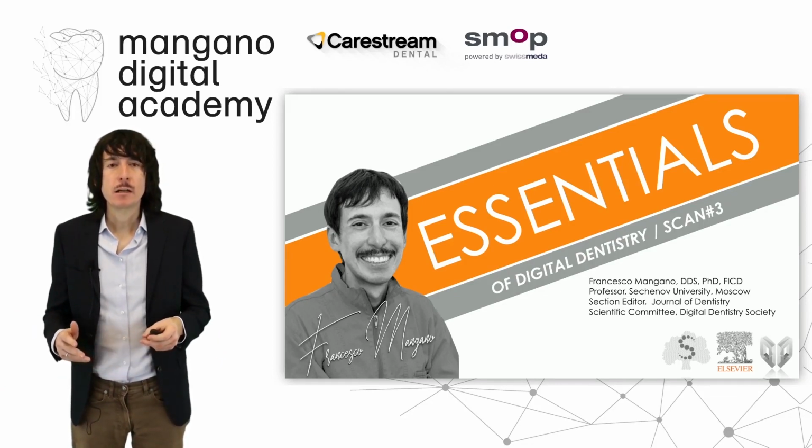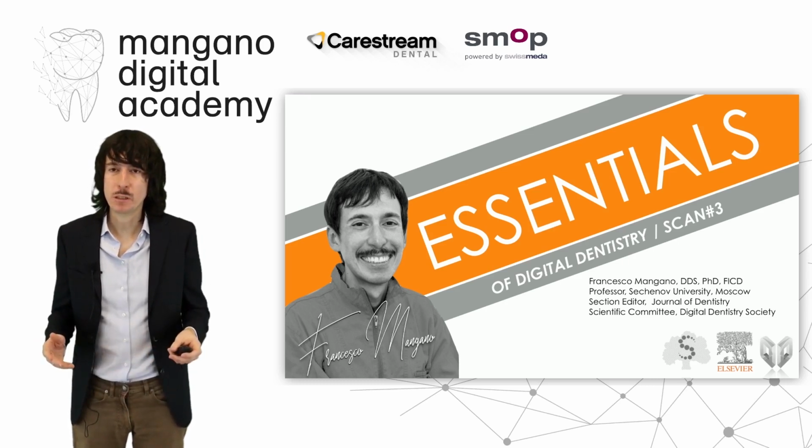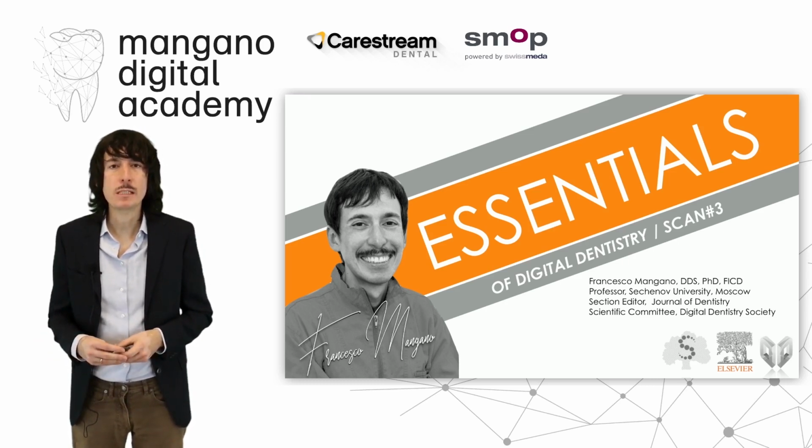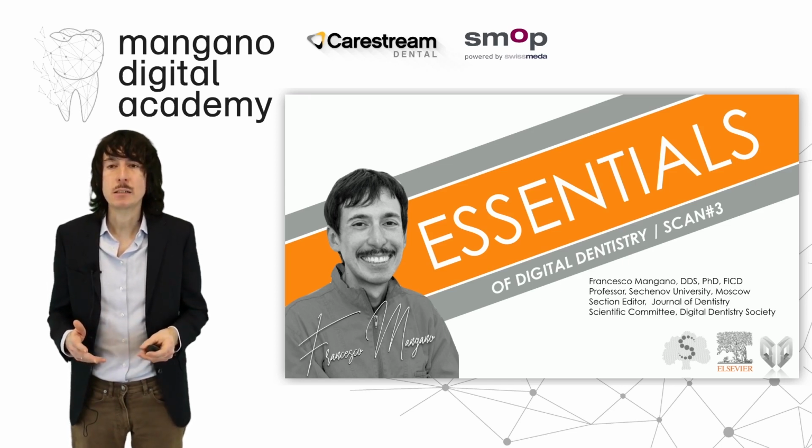Let's again talk about cone beam computed tomography because it's a very important device for the acquisition of 3D data of the bone and teeth, hard tissues of our patients. And it is one of the most important devices in the whole workflow, in particular in the scan phase.